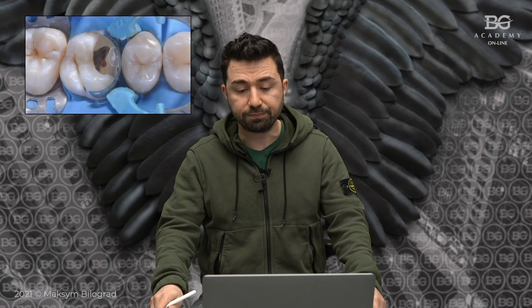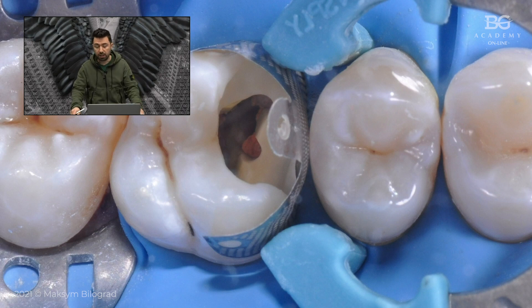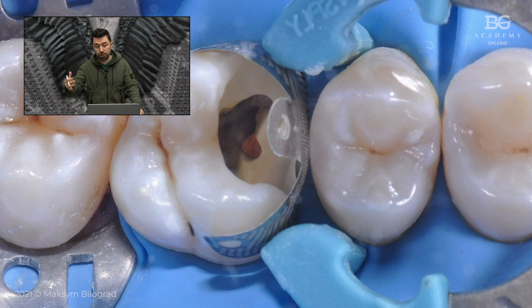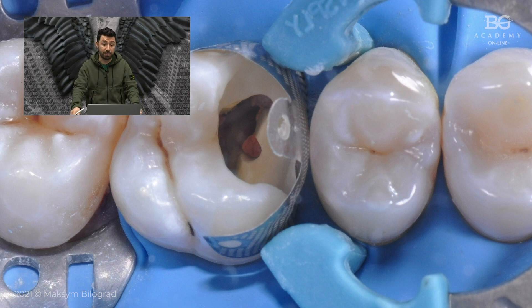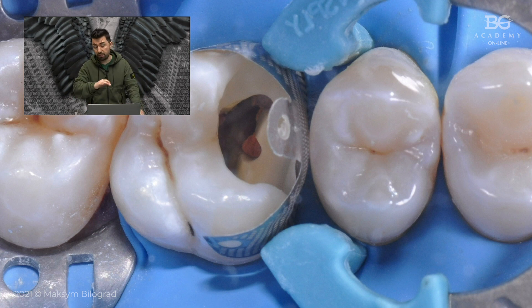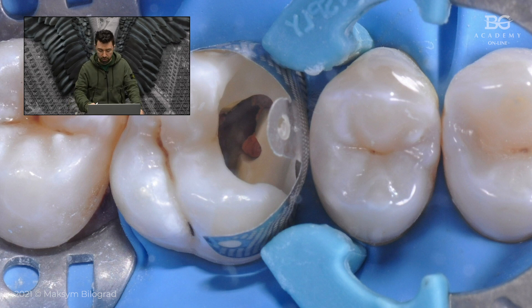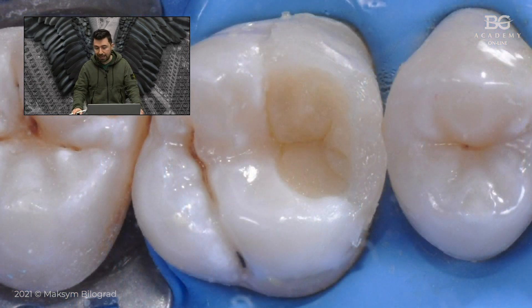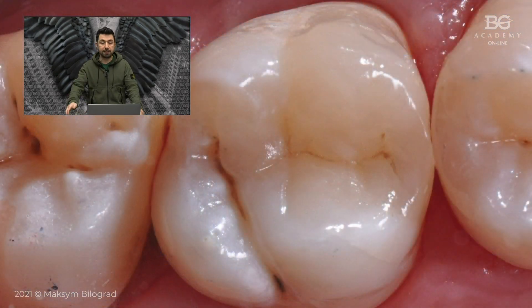For the restorative part, we decided to go with direct restoration. Since the patient is very young — under 20 — we had lost only the mesial ridge and part of the vestibular cusp; the rest was intact. Since we have minimally invasive access, we preserved a large amount of sound tooth structure. The occlusion is also very good: no tooth wear, no bruxism. So we decided to do a conservative direct composite restoration. Here is the dentine layer, here is the final restoration, and you can see the final result.